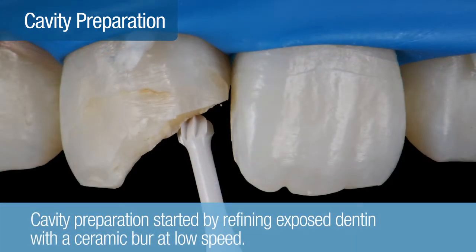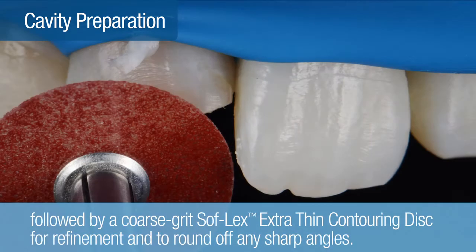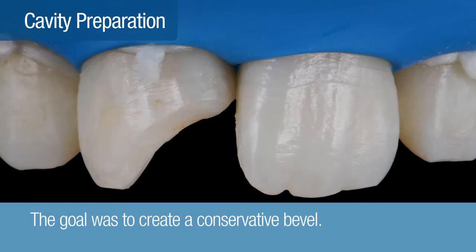Cavity preparation started by refining the exposed dentin with a ceramic burr at low speed. Next, the vestibular bevel was prepared using a fine diamond burr, followed by a coarse-grit Soflex extra-thin disc for refinement. This disc was also used to round off any sharp angles on the preparation. The goal was to create a conservative bevel as shown.